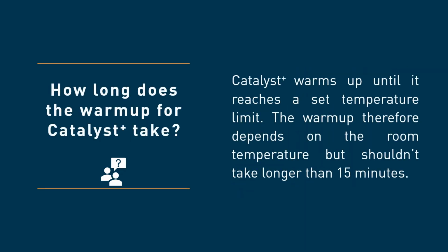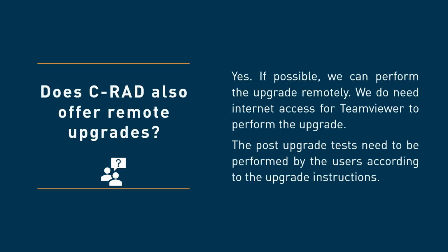How long does the warm-up feature take? The Catalyst Plus systems should not take longer than about 15 minutes to reach its saturation temperature. However, a colder room than originally can influence this naturally. So it's important to let us know if you experience very long warm-up times, so that we can optimize the temperature settings.